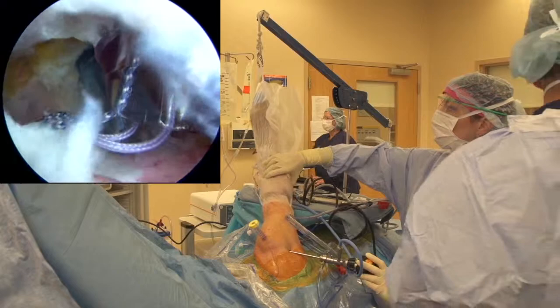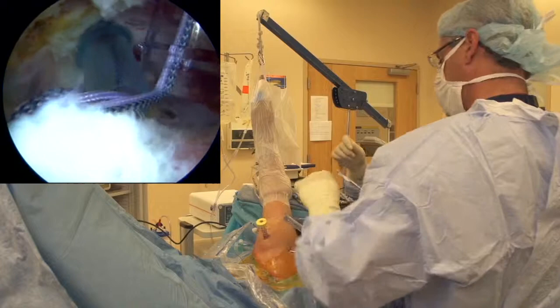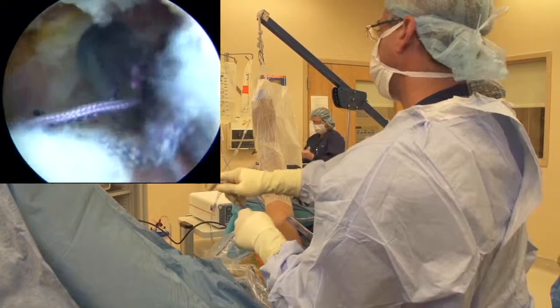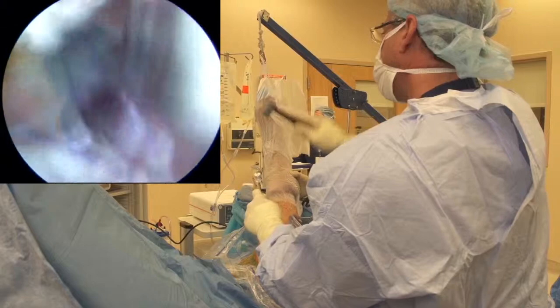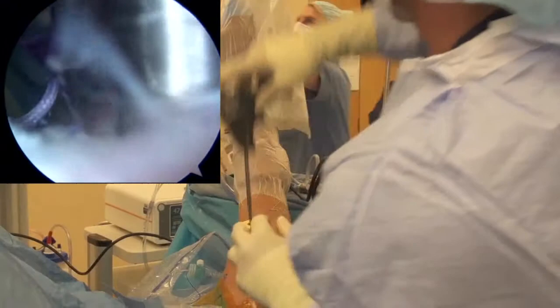You can have the assistant rotate the shoulder a little bit to get better coverage. VersaLock, please. That's a nice technique in the lateral decubitus position to really visualize and put your lateral anchors where you want them to be. This is the VersaLock MyTech anchor - it's loaded directly onto the field, you can put it exactly where you want it to. I'm going to go ahead and pop this in. Want to make sure that you're on the humeral head, which we are. I think we've got decent coverage of that dog ear. Mallet please. We just want to verify that we're well seated, which I think we are. Locking in position - we'll now go ahead and remove this.